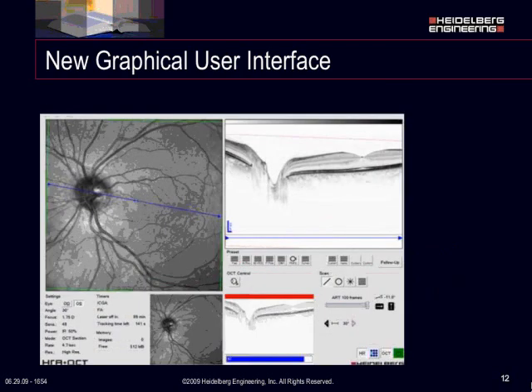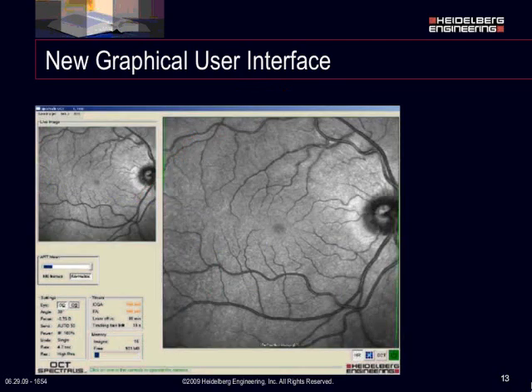This is here an example of the angled scan. If you notice on the right-hand side, it says 11 degrees. So that scan there is tilted 11 degrees, and it will go in half degrees as you start rotating that scan line around. Again, this is just another example of a slightly larger live image when you have the eye tracker active.